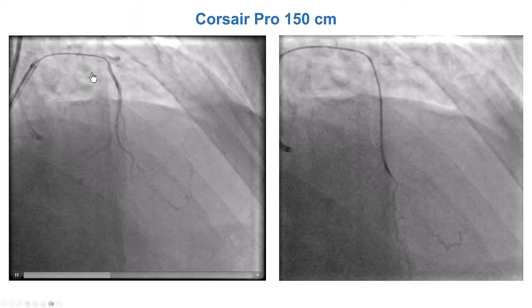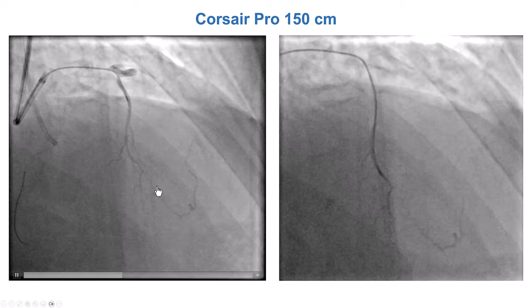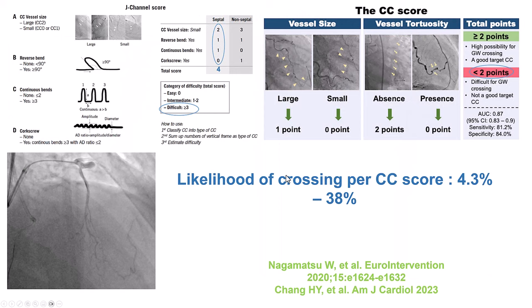A Corsair microcatheter was advanced into this large septal. We can see the connection — it is a fairly small and highly tortuous collateral. We used different scores to assess the difficulty of crossing this collateral: the J-channel score and the CC score (collateral channel score) from Taiwan. The CC score considers vessel size — large scores one, small scores zero — and tortuosity. No tortuosity gives two points; tortuosity gives zero. The J-channel score looks at size, reverse bend, continuous bend, and corkscrew morphology. In our case it was four, meaning the likelihood of success was low, so we knew this collateral was a challenging one.